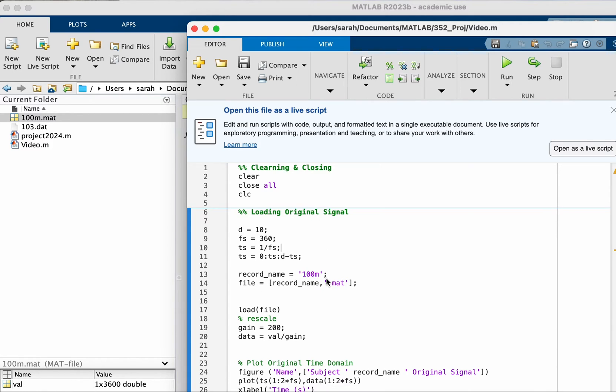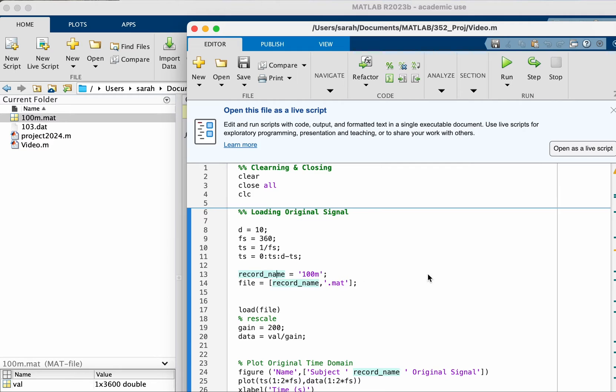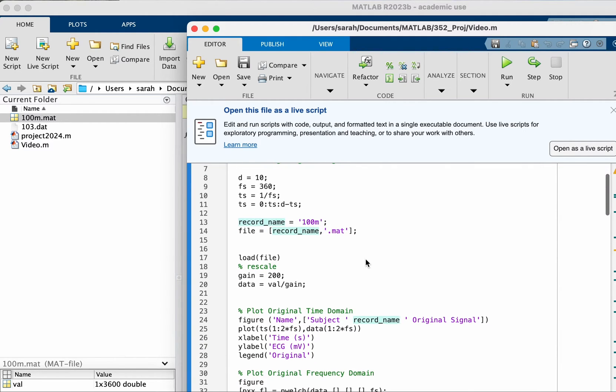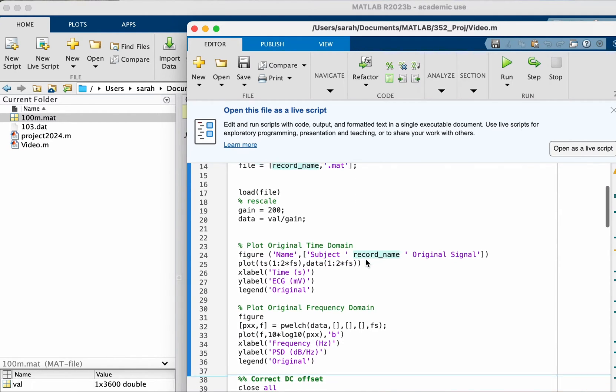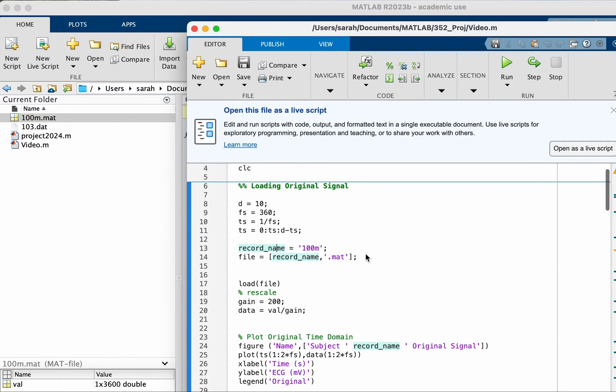Another way to do it would be in code to specify the name of the record and then how you're going to access that file. This is useful if you're doing a loop, then your record name here would be a vector of the different names of files that you have. There are different ways to automate but that's not the topic of this video.